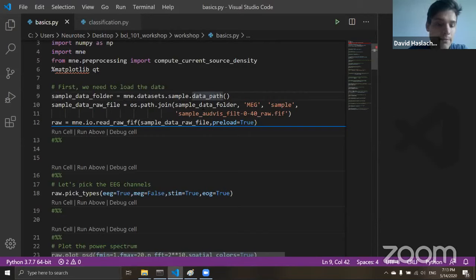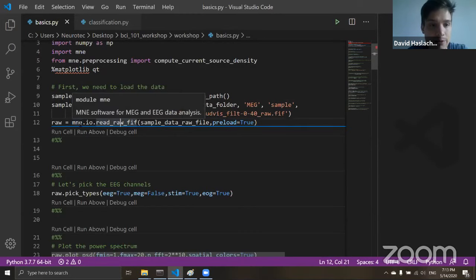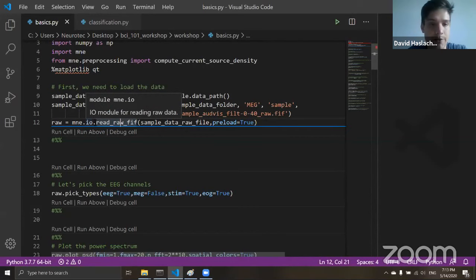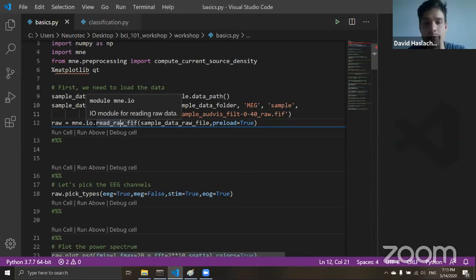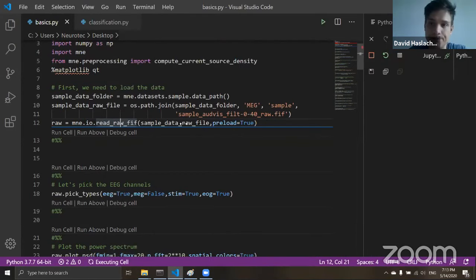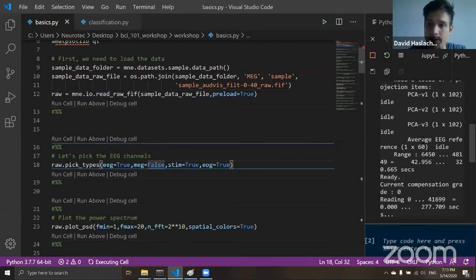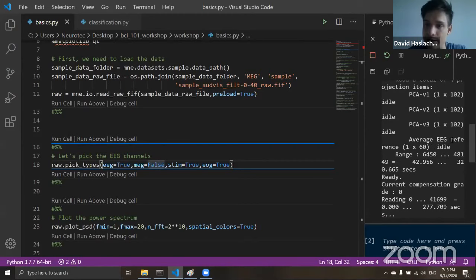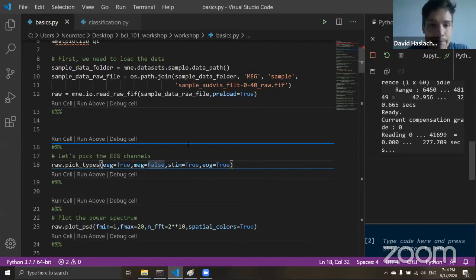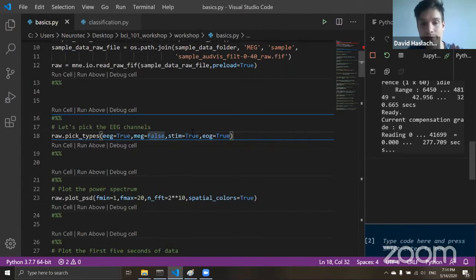This dataset is in the MNE installation path and we read it using MNE IO read_raw_fif — FIF is a very common neuroimaging format. MNE has a bunch of other read functions for all sorts of EEG and MEG data formats, so whatever system you use, MNE will basically be able to read it. We'll run that code cell and have our data loaded. Here we see some basic information about the EEG data — how many channels, how long it is, and so forth. You may notice it says MEG — this dataset contains both MEG and EEG recordings, but we're only going to focus on EEG.